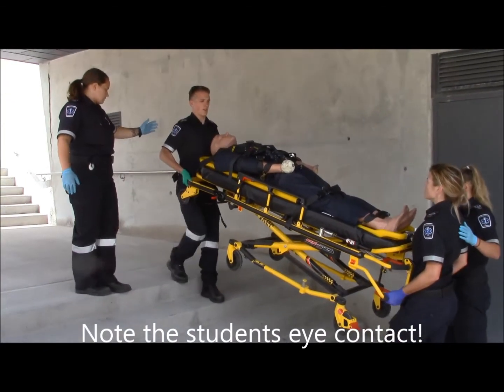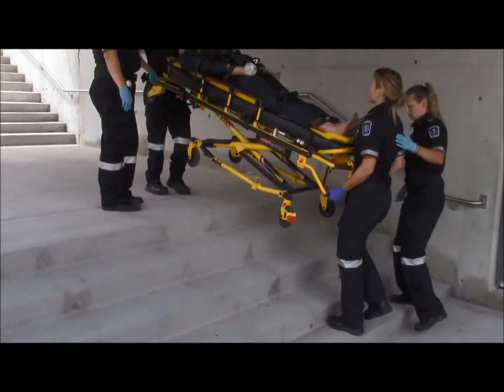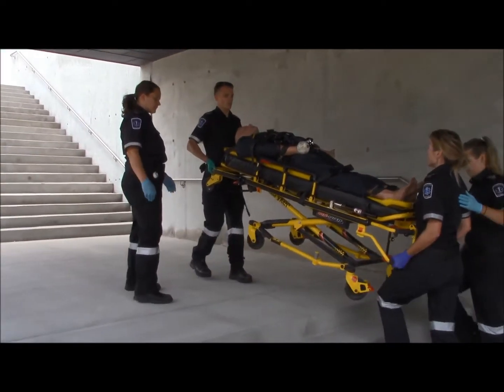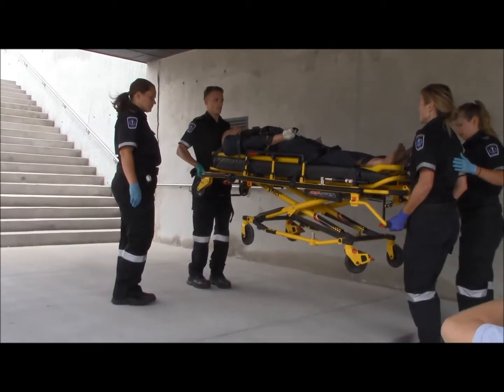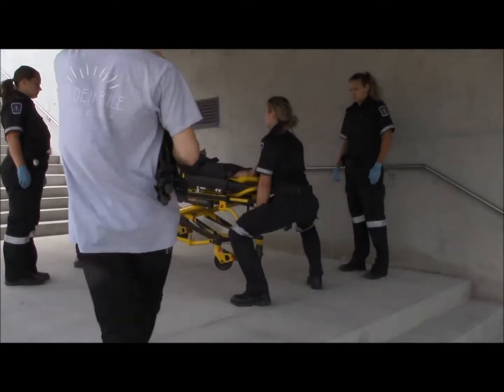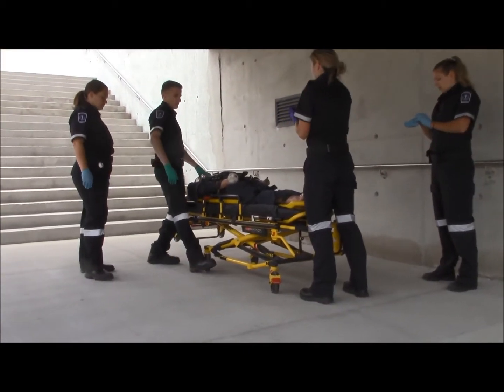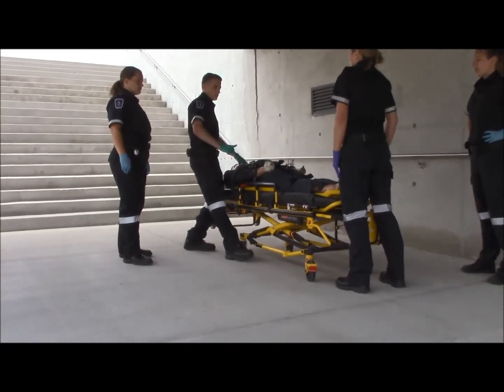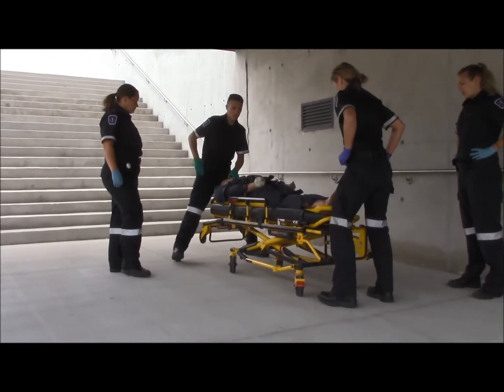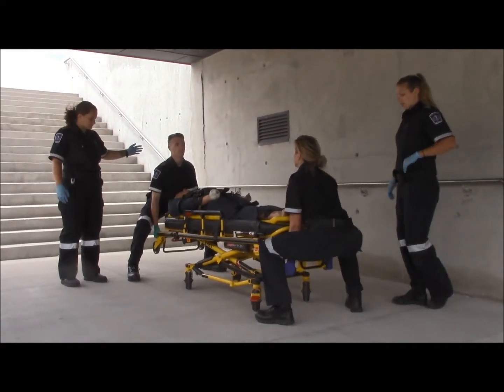The same communication applies during this lift as does any other lift. The person at the foot end would now be saying step, step, step, etc. And the spotters are there to help you as well. Do not trade places at this point because you'll get an opportunity to do this lift once again.